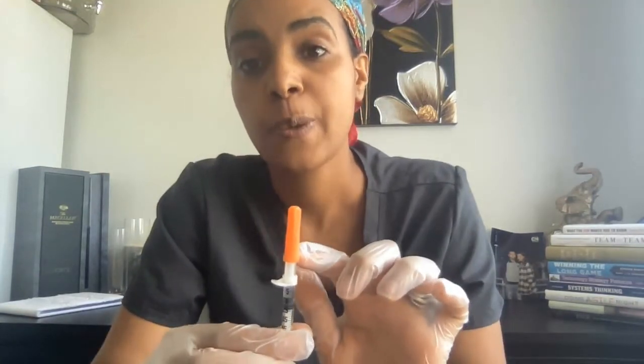The reason we cap this up with the scoop method is for safety, because there are a lot of needle stick injuries, so to prevent that, that's what we do. Make sure you label it with the name and the dose, and take it to the patient side.